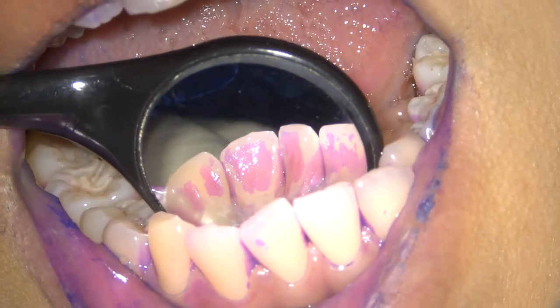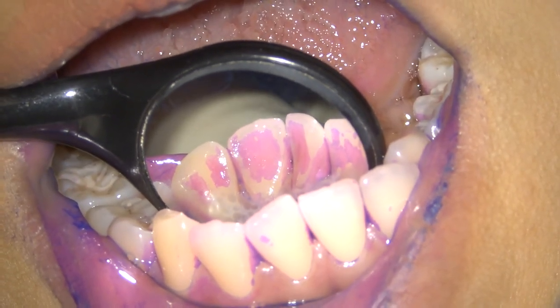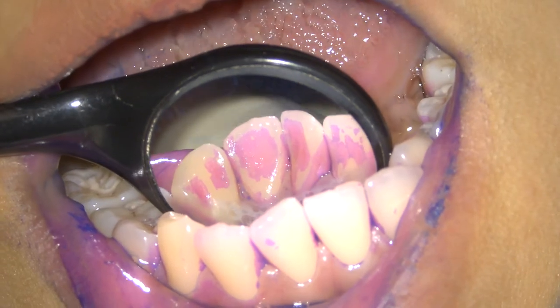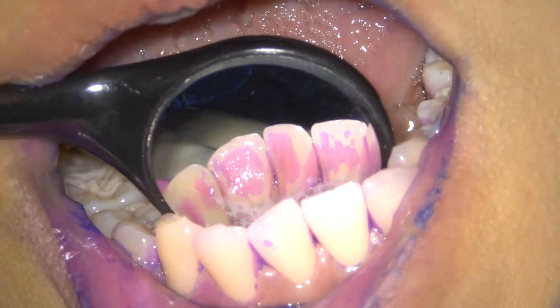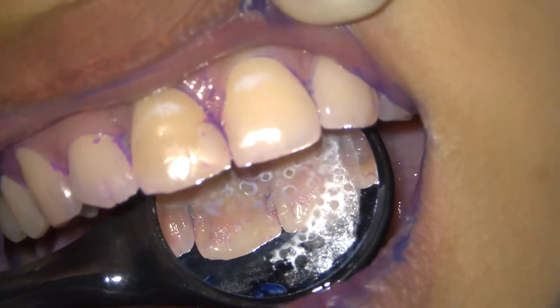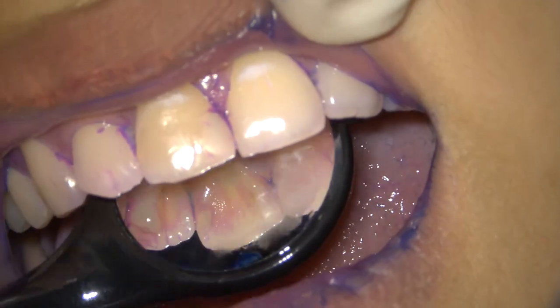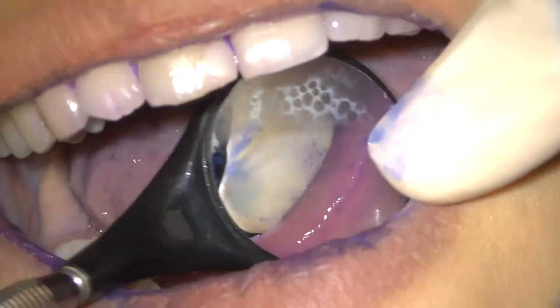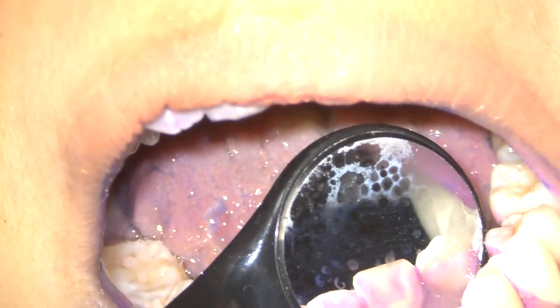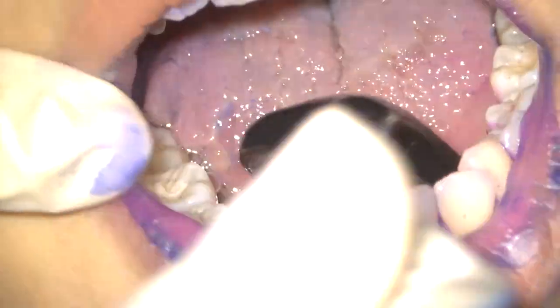Now you can see in the mouth mirror that there is obvious staining of the plaque present on the lower lingual surfaces of the teeth, and this also is mostly a fresh plaque. Let us see the upper surfaces. I hope you can all appreciate the type of plaque that is present on the other teeth surfaces as well. Even in the posterior teeth I can show you there is plaque deposition present in these teeth.